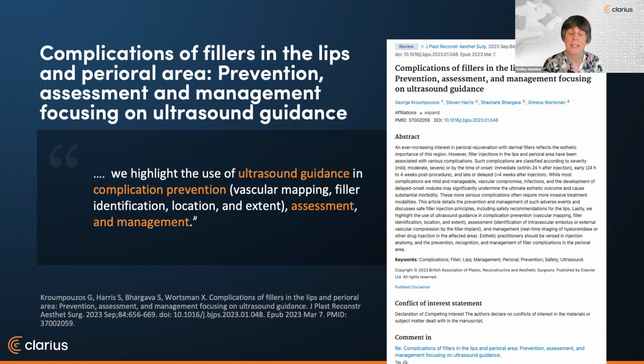And this next paper is a narrative review of the consensus statements of expert practitioners and various literature on the injection points and techniques. This review mentions the merits of ultrasound-assisted and guided botulinum toxin injections in all areas of the face, including the importance of visualizing the masseter muscle prior to injection. So you're going to get a really good look at all kinds of ultrasound anatomy today.